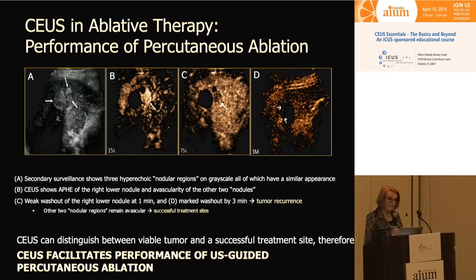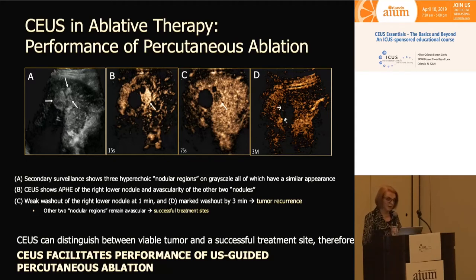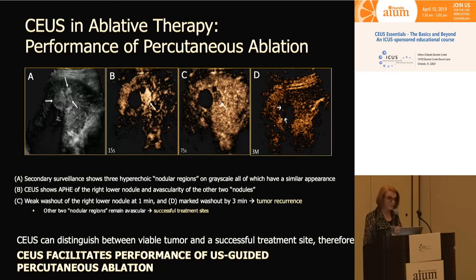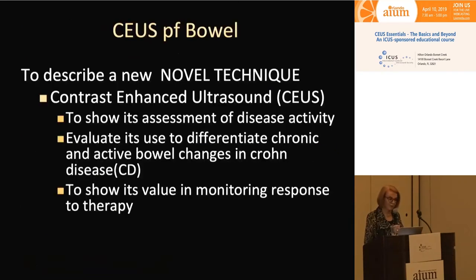Looking at another valuable case: a patient who's had several procedures for HCC in the past. On grayscale, we see not one, not two, but three echogenic nodules in this liver — very hard to tell what's abnormal. When we do CEUS, we can see easily that one nodule is hyper-enhancing. The hyper-enhancing nodule then shows washout — we know that's HCC — and that specific nodule can be targeted for re-ablation.